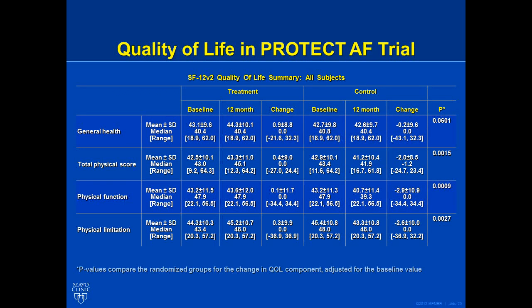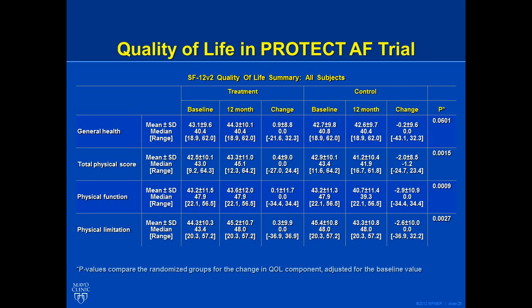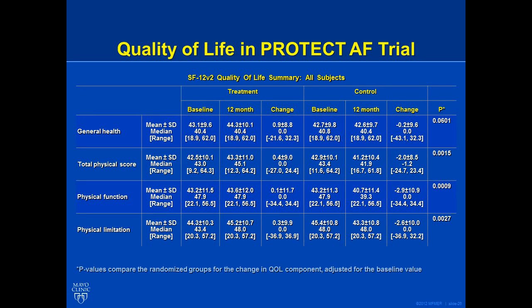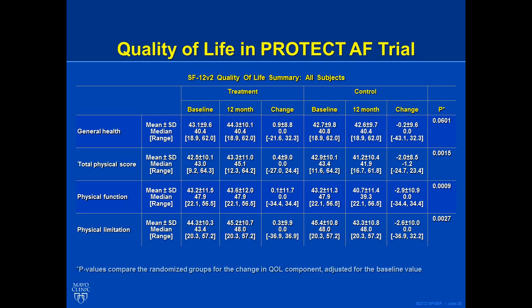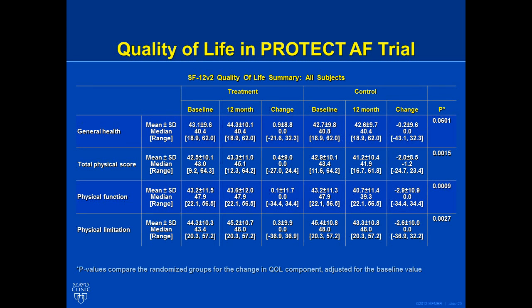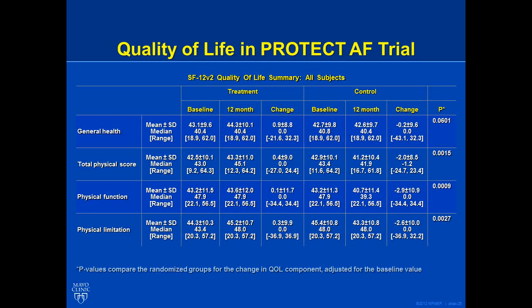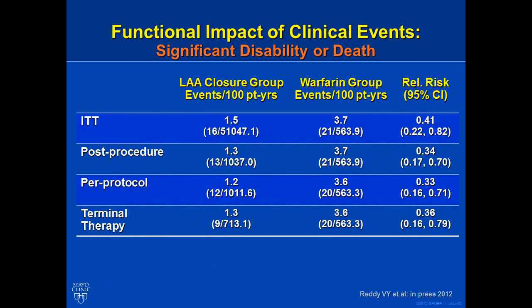The next piece of information is to say, and this Sean Ali in the audience over here in the middle has written this up, and has it just come out now? Just come out now on quality of life. As we get to patient-centric care, quality of life winds up being a huge issue. This is the only piece of information. So we only have one randomized trial, and only one piece of information on quality of life in the only randomized trial. And Sean found that indeed, if you received the device rather than warfarin, you felt better. You didn't have to be concerned about cutting yourself when you were shaving. You didn't have to be concerned about not eating too much spinach or leafy vegetables because somebody said that would screw up your INR.